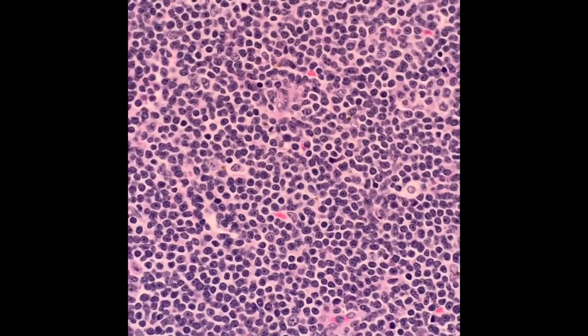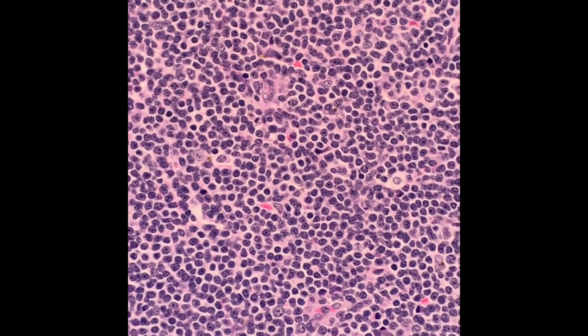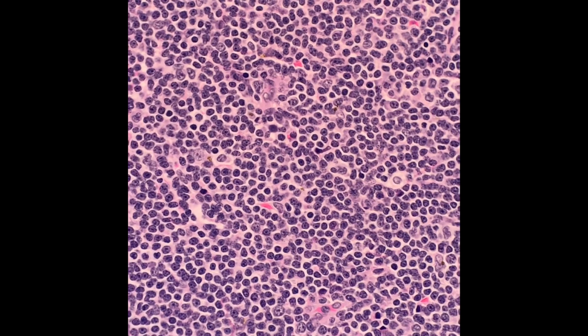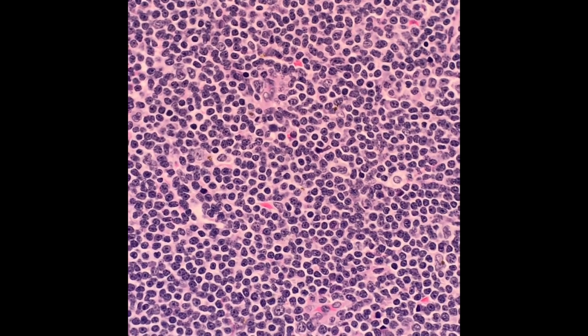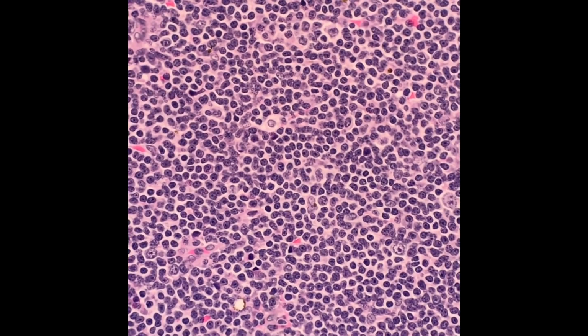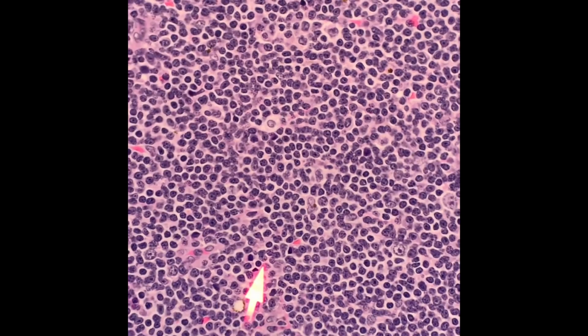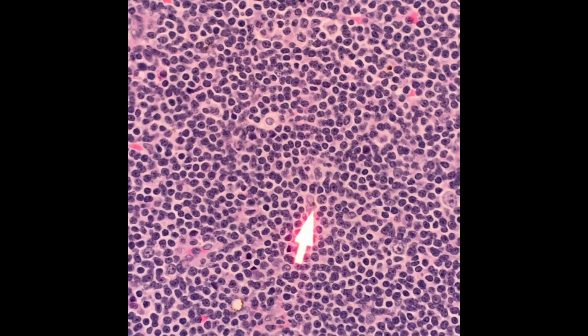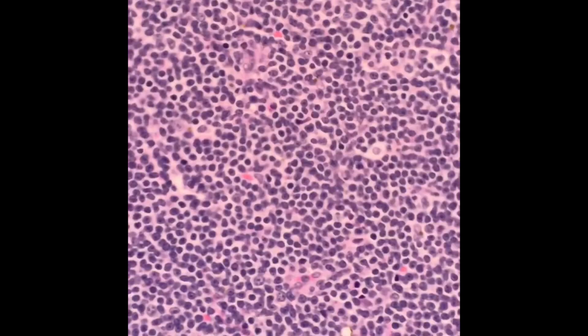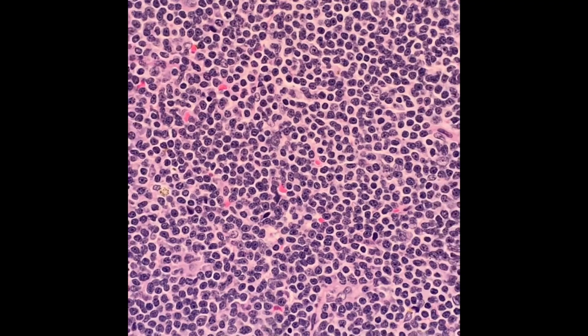So, to my eye, this is an extremely monotonous proliferation. And there's very few things in lymph nodes, benign or malignant, that are truly monotonous. Another finding we see in this lymph node is hemosiderin in macrophages. That's something we might frequently see in lymph nodes from the axillary region.